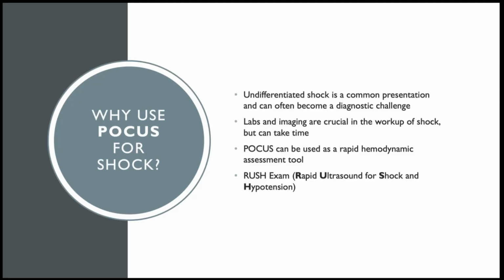So the main question, why are we using ultrasound for shock? Shock, especially undifferentiated shock, is a common presentation in both the ER and ICU settings, and it can often become a pretty big diagnostic challenge, as many patients can initially present similarly with hypotension, tachycardia, altered mental status, making figuring out the different causes of shock very difficult. In a setting where early diagnosis with proper treatment has been shown to decrease mortality.